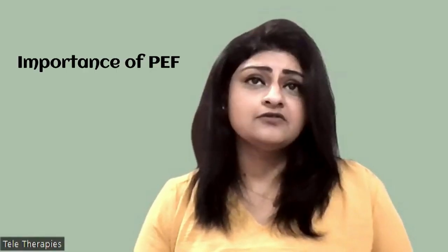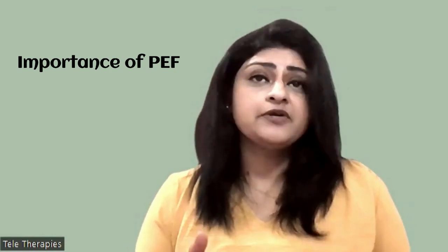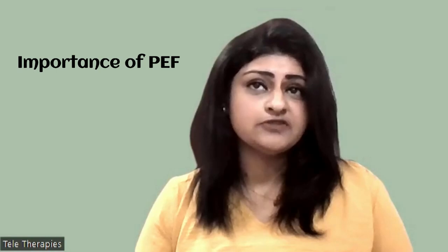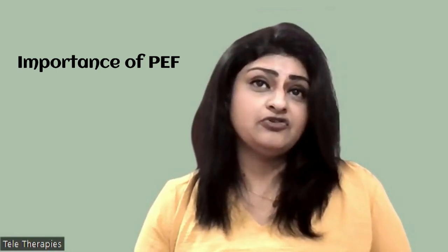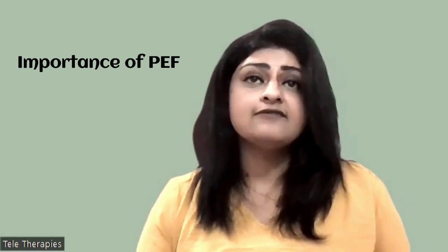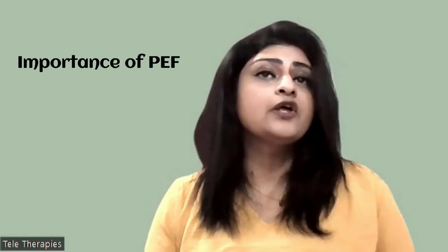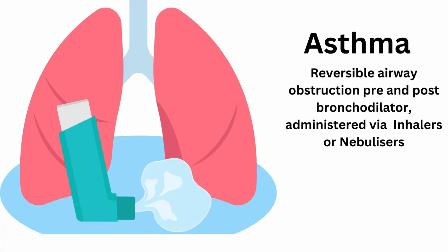Let's emphasize the importance of peak expiratory flow for early diagnosis of respiratory conditions. Since peak expiratory flow reflects the degree of airflow obstruction, monitoring changes over time can help identify potential respiratory problems before they escalate to severity. Early detection allows for prompt intervention and management, reducing the risk of severe complications and improving long-term outcomes. Especially in asthma, a key component measured is whether there is reversible airway obstruction pre and post bronchodilator administration.